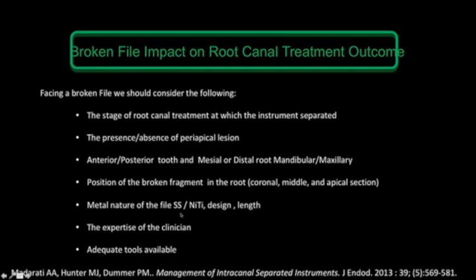So, more details about the broken file, what should we consider? Of course, the expertise of the clinician and the adequate tools available. If we are facing a broken file and we think that this is a very extreme or very advanced case, not a maxillary incisor with a very long file, we should use special tools, or we should have at least experience how to remove it. So we are going to decide either we refer the case or we try it ourselves if we have the experience.